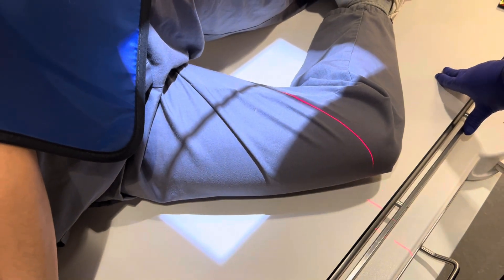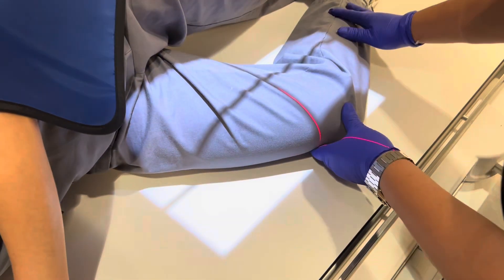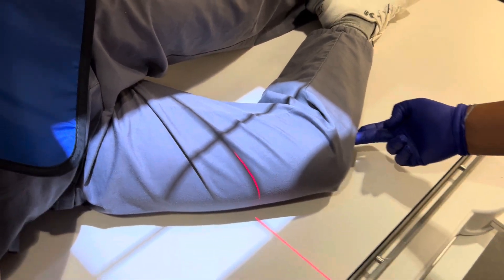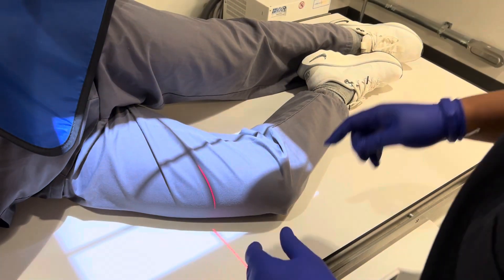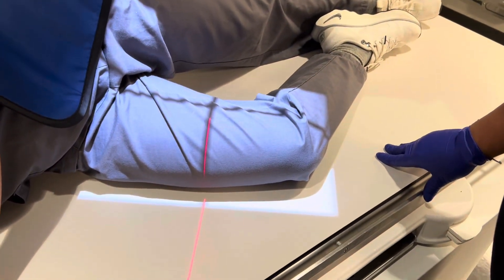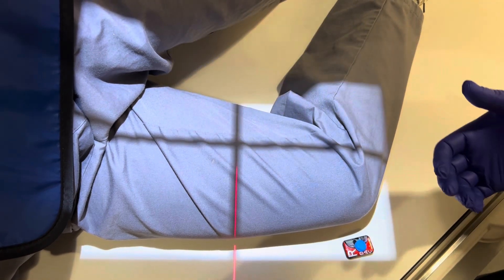Her tibial tuberosity is here, so that's where I want to make sure the bottom of my receptor is at. Watch this — we're going to turn the collimator. I want this line going down the mid-portion of her femur. I'll put my marker right here. So this is going to be your distal femur lateral.